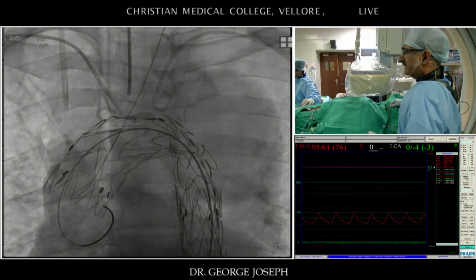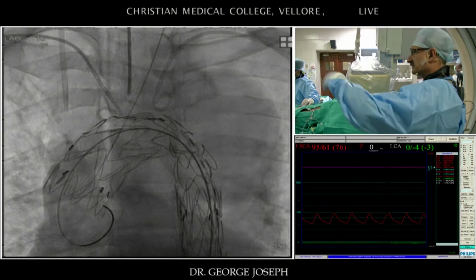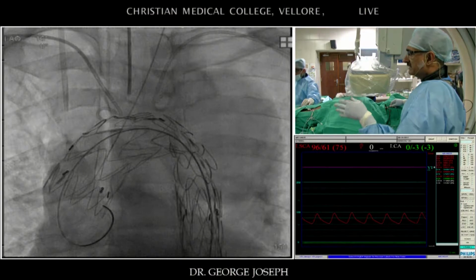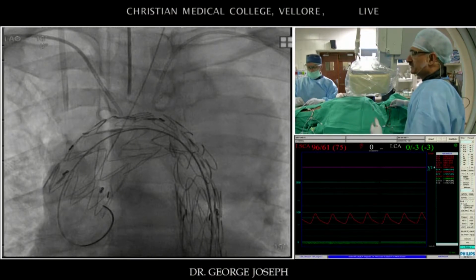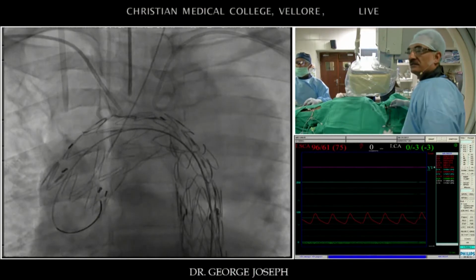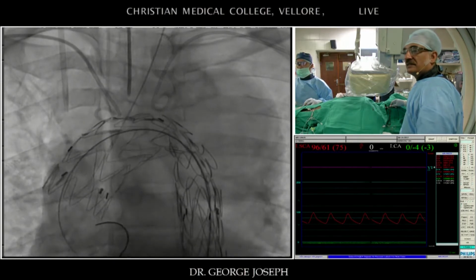One important thing while working on such cases, we have these long wires going down the table. I always try to clip them at 1 or 2 points, because before you know it, there'll be one end on the floor. It's something which we've learned the hard way.